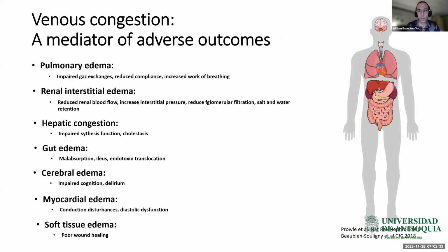Namely, portal pulsatility showed a positive association with pulmonary artery pressures, most components of the right atrial pressure waveform, and right ventricular pressures as well. It also showed a negative association with mean arterial pressure, cardiac index, and mean perfusion pressure. Also, there was a significant association with RV systolic and diastolic dysfunction on echocardiography.